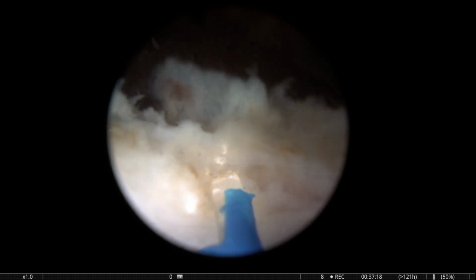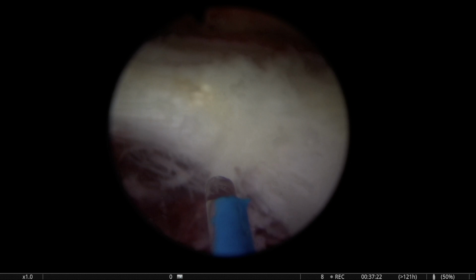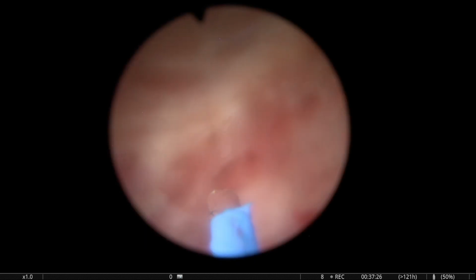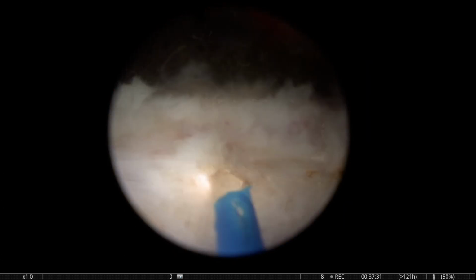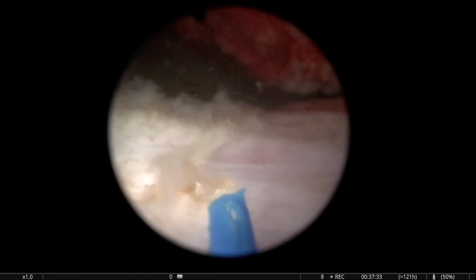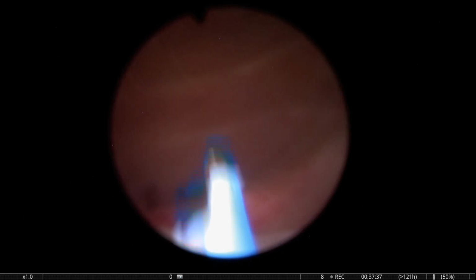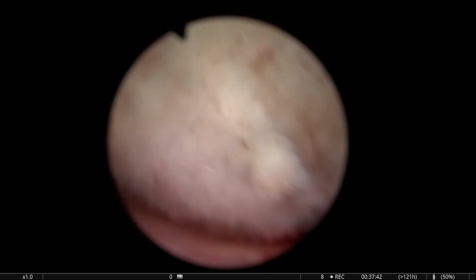So spend some time doing hemostasis before morcellation, especially when you start with HoLEP, because I have to say, with practice and with experience, you can morcellate under bad visibility conditions. I put the tip of the morcellator on top of the bladder neck, I separate from the bladder, and often even with relatively bad visibility we can morcellate safely.